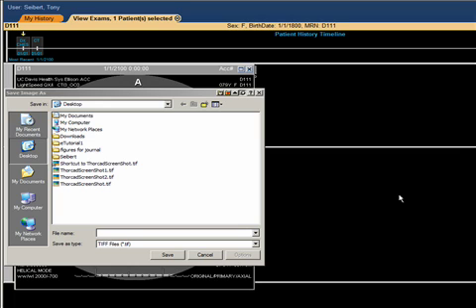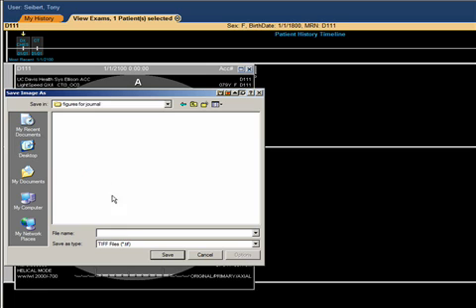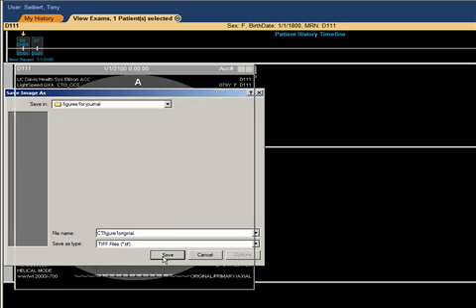Selecting an appropriate file folder output, I will save this as CT Figure 1 Original and save to disk.